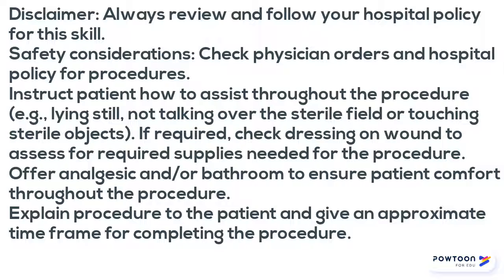Disclaimers: always review and follow your hospital policy, check safety considerations, and double check with your physician and other policies and procedures. Instruct your patient on how they may assist you throughout the procedure by lying still, etc. If required, check the dressing on the wound and assess required supplies needed for the procedure.